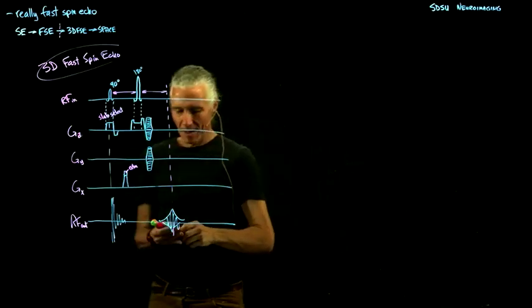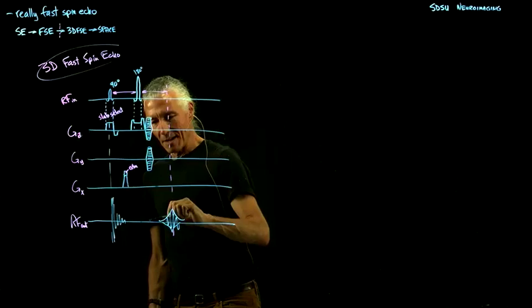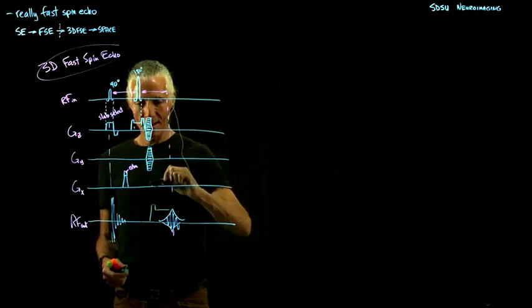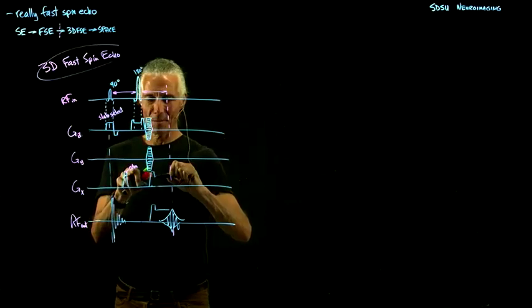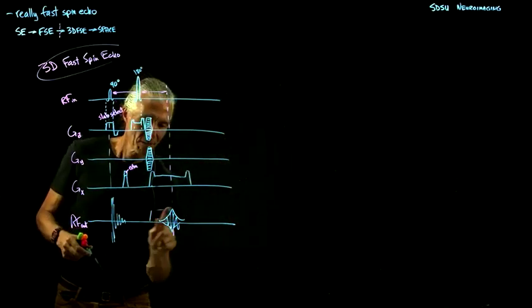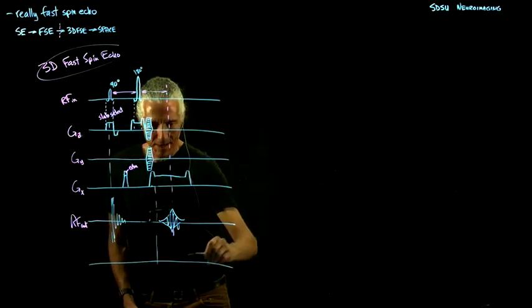And so then we're ready to record some data. Usually what people do is they've got another little crusher on this guy. Let's put a little ear on this one. Since we had a 180, it kind of fixes up this extra business here. And we go across and then put another little crusher like that. So that's our readout, and so then we record the data here.